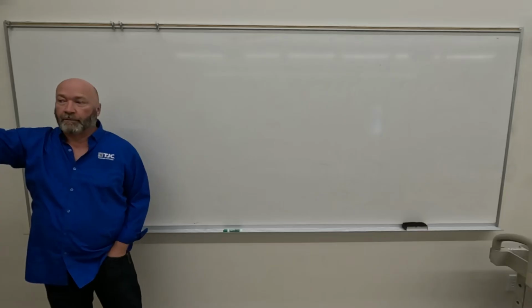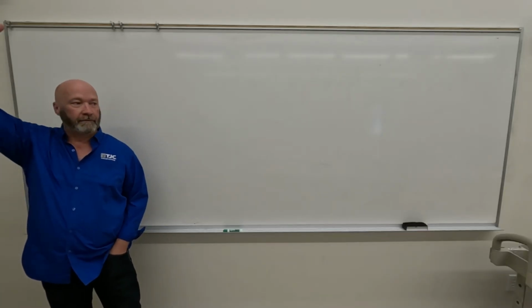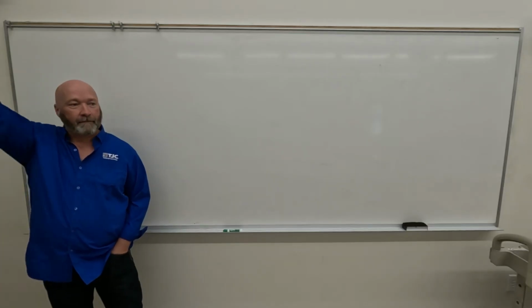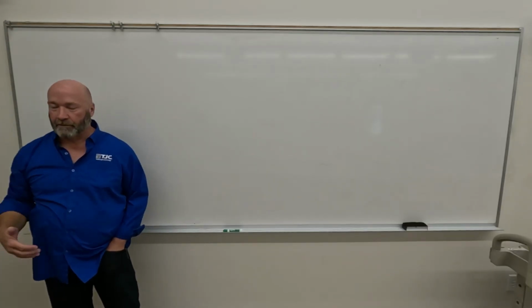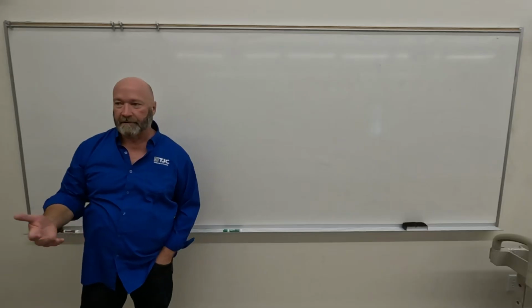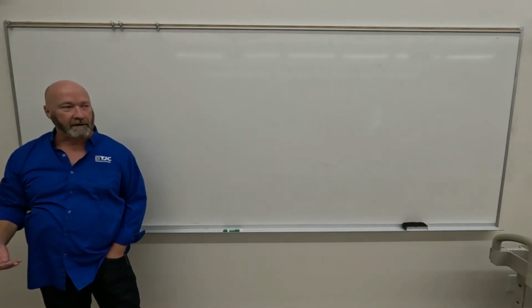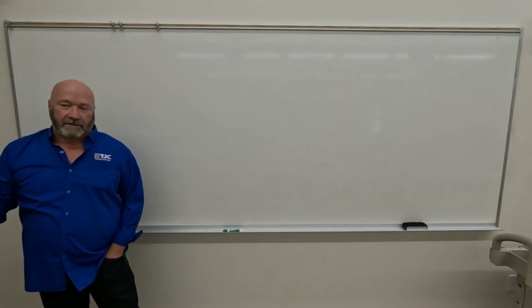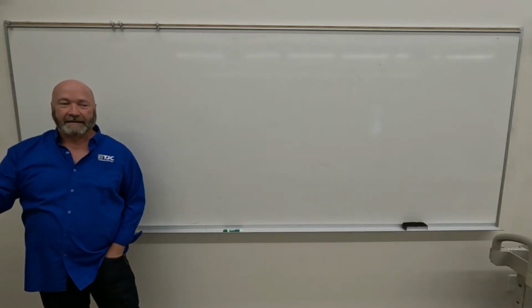So you have to have a superstructure above to hold everything up. So there's a lot of metal up inside above the support system. So if you go to your doctor's office, and it's 1 story tall, unless it's 30 feet worth of 1 story, you're just not going to have that type of x-ray tube.